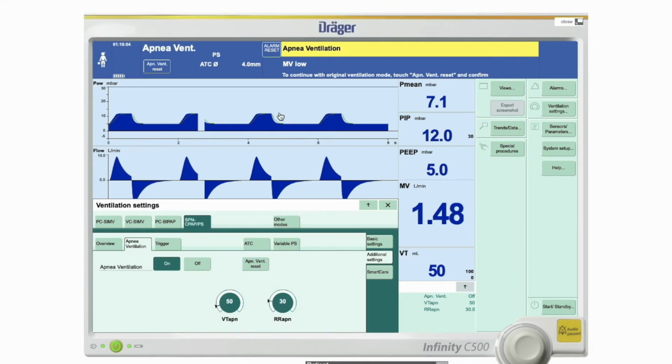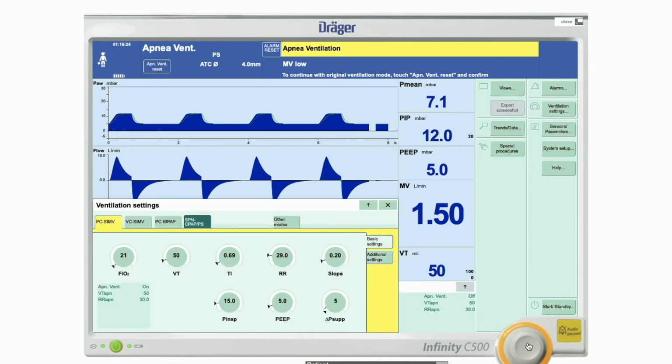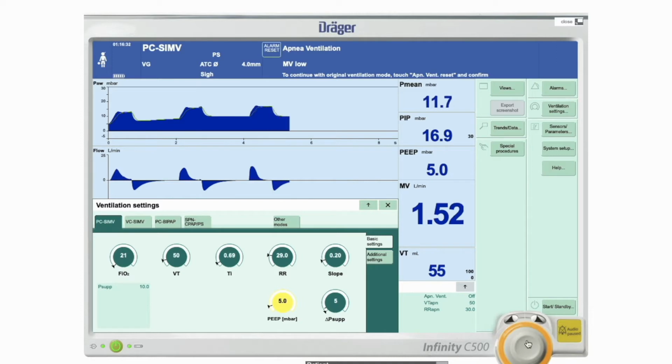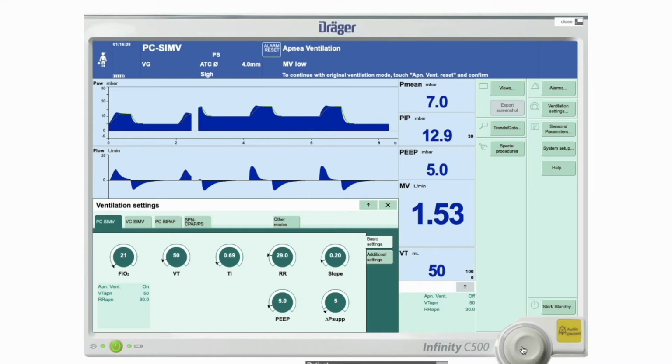So because he's getting that ventilation, the minute volume alarm that was here previously that was red has gone away because the patient's now being ventilated. But the ventilator is still flashing at us, telling us there's something wrong. I'm in emergency mode. You need to do something. So what you then need to do is come back and decide, okay, this patient isn't ready for CPAP yet, or maybe he's oversedated, needs something doing to him. But you need to agree that that's the problem and do something about it. And once you actually change it, the alarm can go away.